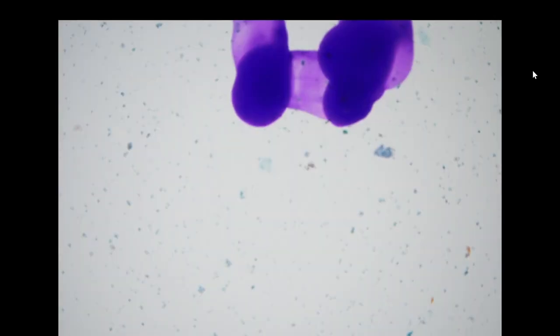So next is also a urine cytology specimen coming from an 83-year-old male. Dr. Shi also actually saw this specimen last week from the same patient, and this is the third specimen from the same patient. So on low power, this is a voided urine. On low power, we don't have a lot of cells because it is a voided urine.